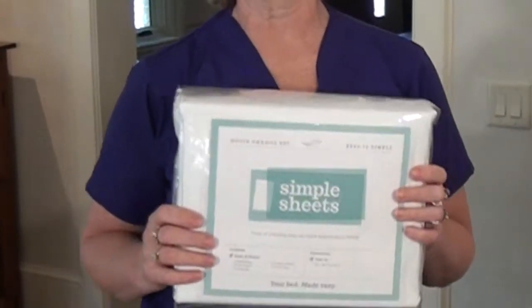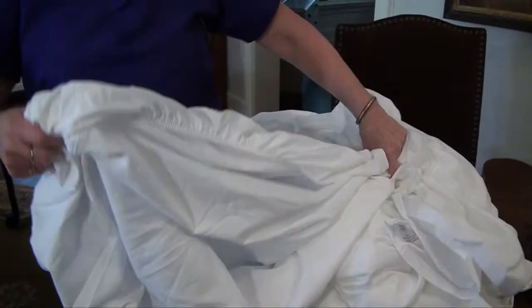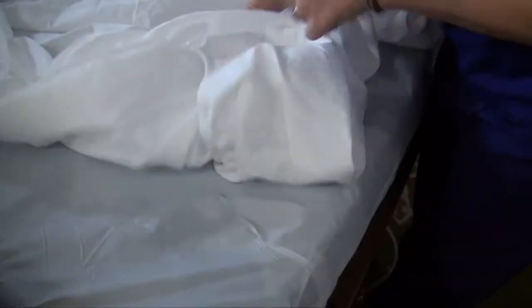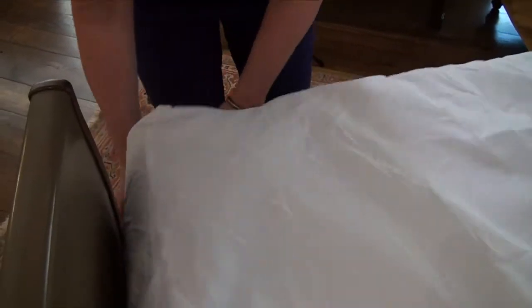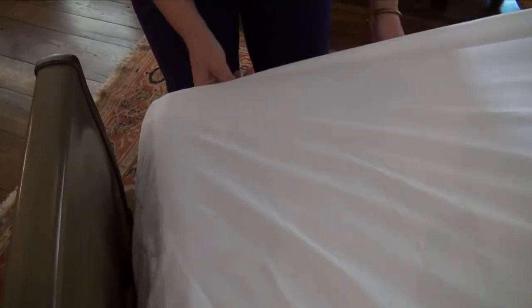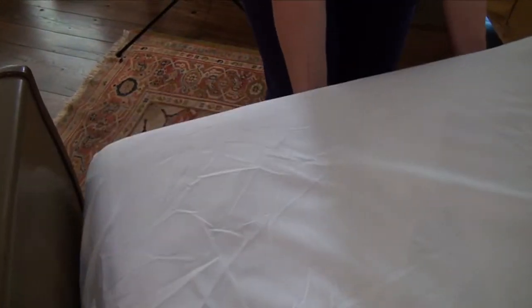It is more comfortable for the patients. I wish I had had these sheets back in the 1970s when I started nursing. So we're just going to simply make a bed. First we're going to take our quick-change base fitted sheet. The one thing to remember is to make sure that the Velcro is on the top. The sheets are made perfectly to fit any home hospital bed. They're easy to put on and they fit nice and snug.